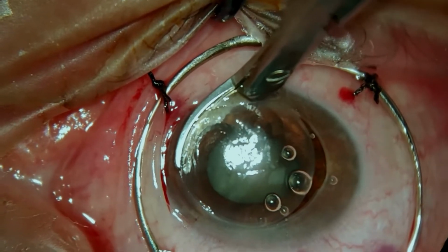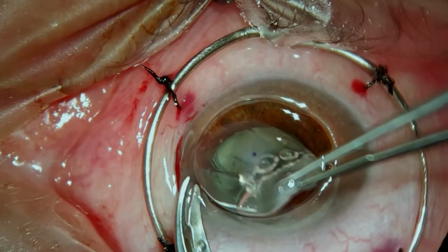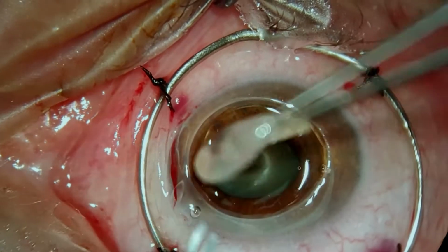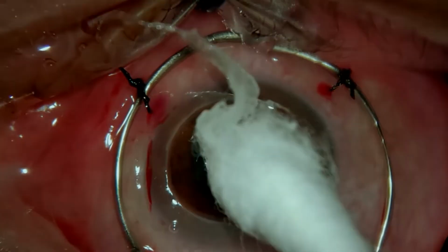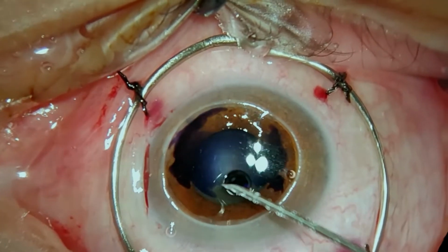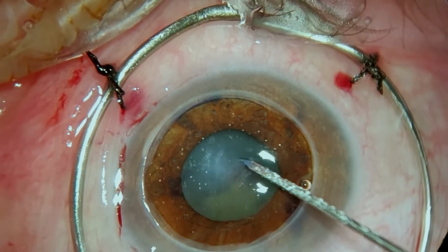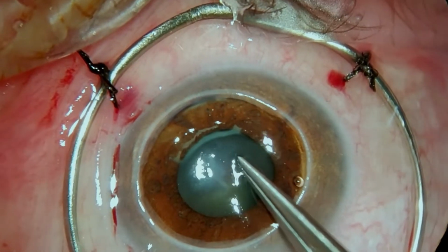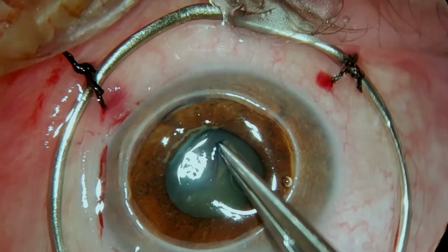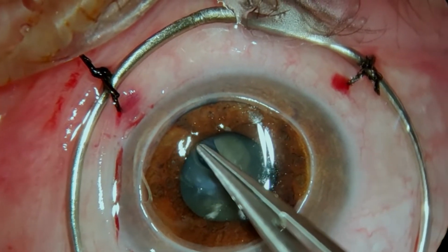This is quite important. Some surgeons, while reaching the end of the cut, leave a hinge of cornea to have a safeguard in case of an intraoperative choroidal hemorrhage. We didn't do this in this case. We then dry the AC and stain with trypan blue. We use any sort of sharp needle to puncture the anterior capsule, and then using non-toothed forceps we do the open sky rhexis.